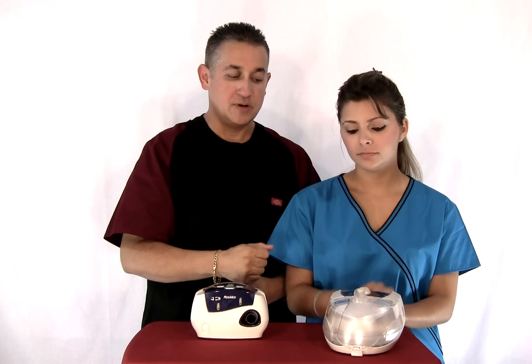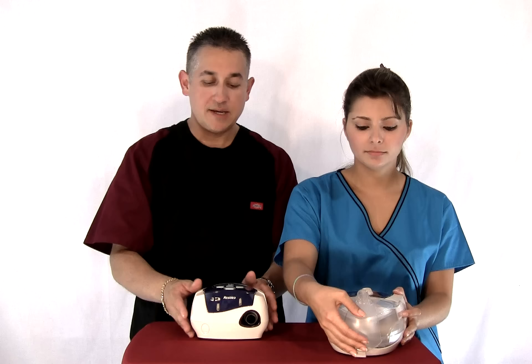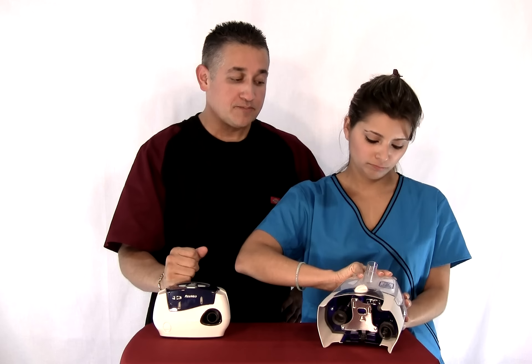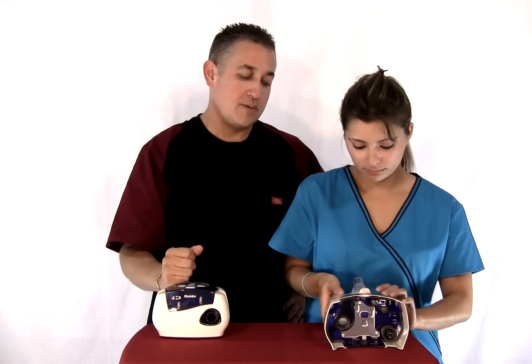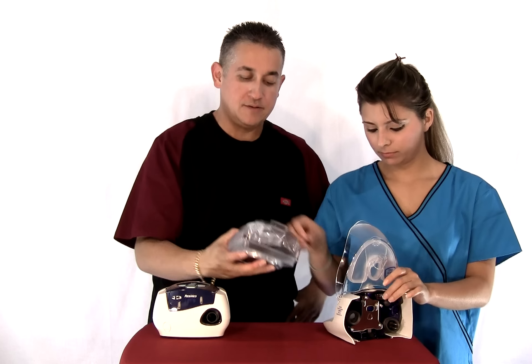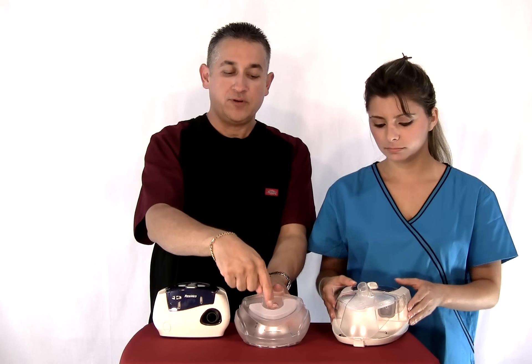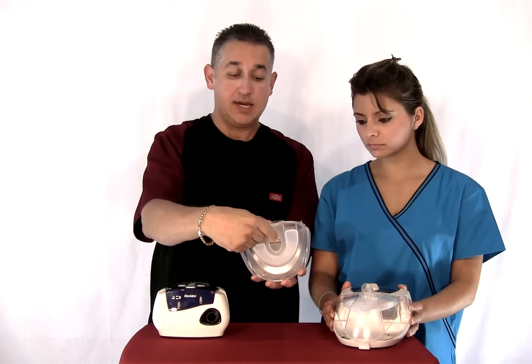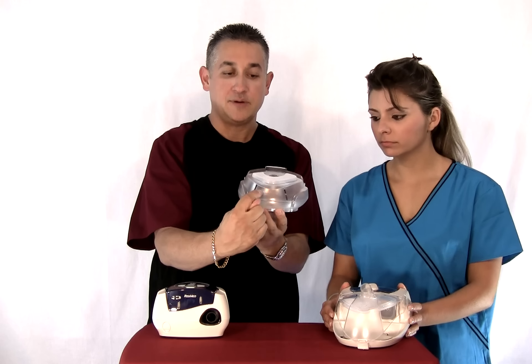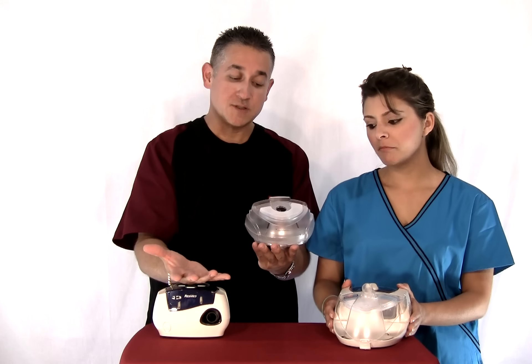I'll show you this is the humidifier, and I'll show you the tank. The humidifier needs to be using distilled water. It's very easy to access — the water will be filled in through the top and you'll go right up to the line. There's a max line right there. I always suggest distilled water; it's what the manufacturer suggests also.